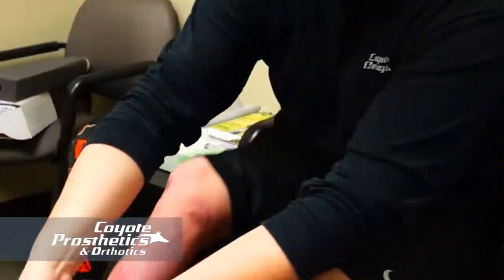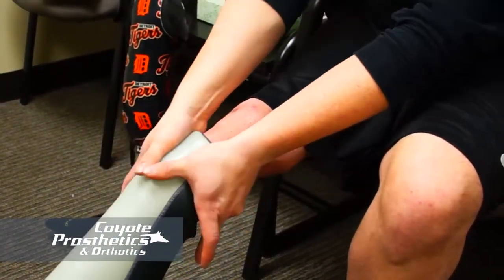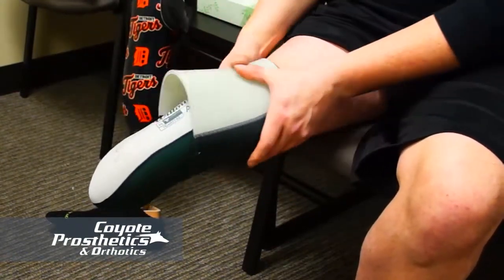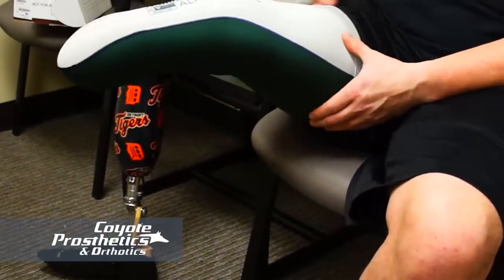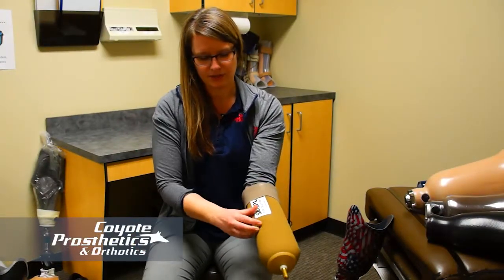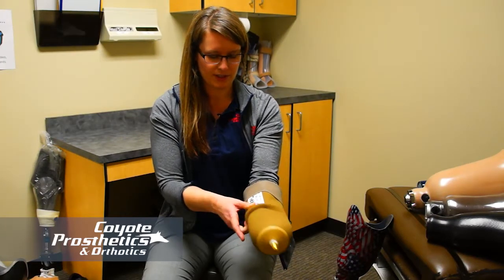Then you're going to want to take this part, put it right up against the distal part of your residual limb, or the end of your leg. You put it right onto your skin, and then you can roll this up. You can use both hands and just roll it on there. You want to make sure that you don't have any wrinkles. Sometimes in the back of your knee specifically, you'll get a wrinkle like that. You're going to want to make sure you don't have any of that.